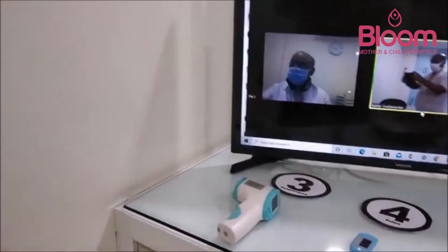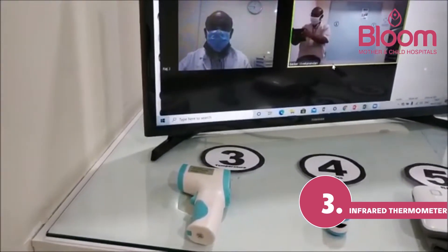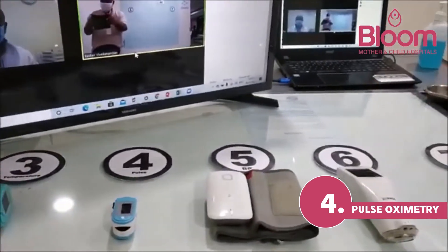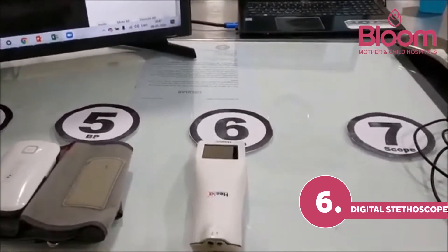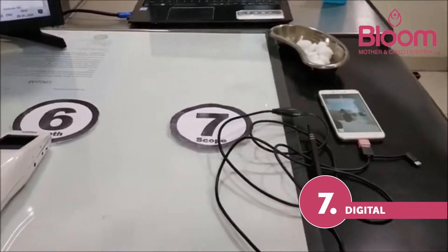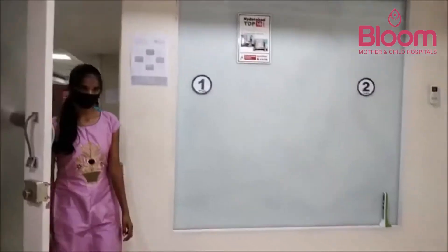At station three, with the doctor's instruction, there is an infrared temperature measurement device. At station four is a pulse oximeter, at five a digital BP apparatus, and at six a digital stethoscope — while the patient checks heartbeat and breathing sounds, the doctor can hear it on the other side. At station six there is also a digital otoscope for capturing ear images.